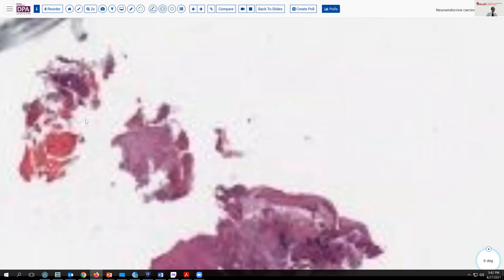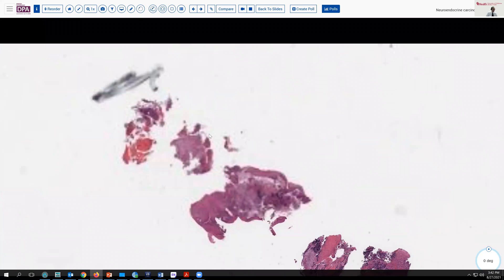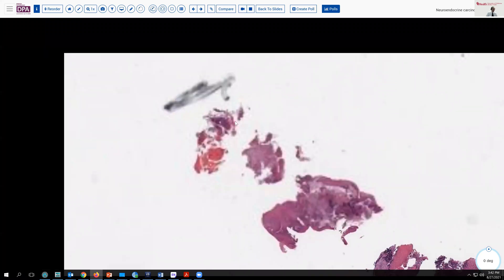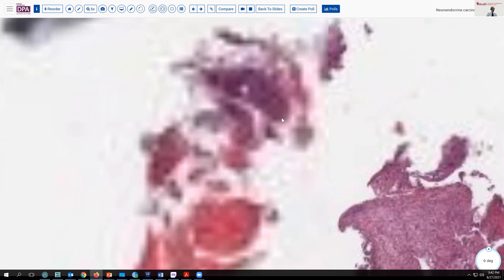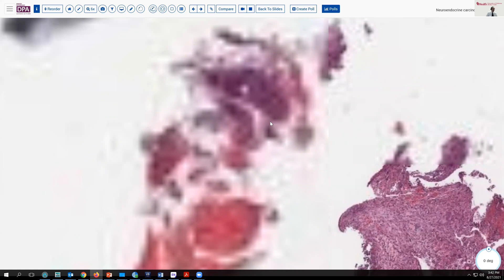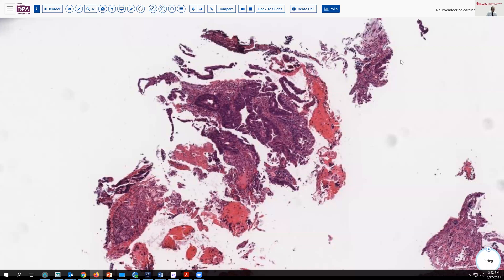Let's go back out to low magnification and let it sort of start over. Let's focus here on this area and let the slide load and depixelate. We see more granulation tissue. But as this piece comes into focus, we see that additionally to this ulcerated area, we have some gland formation here.